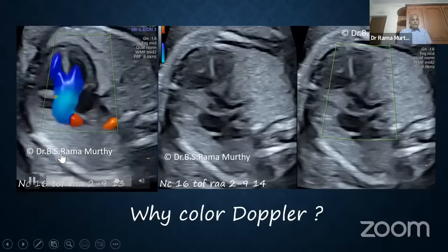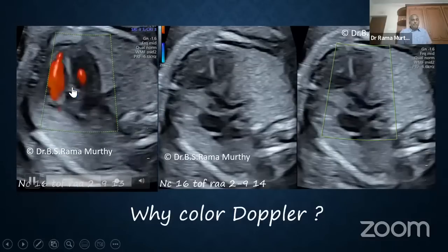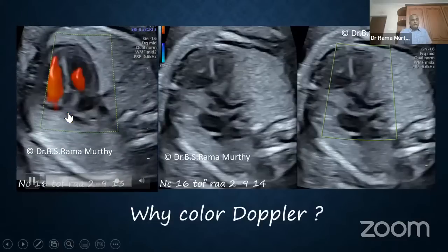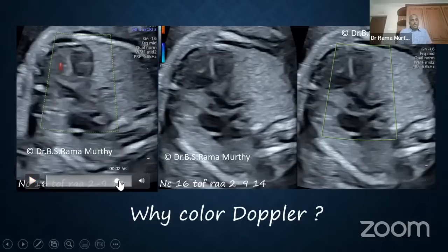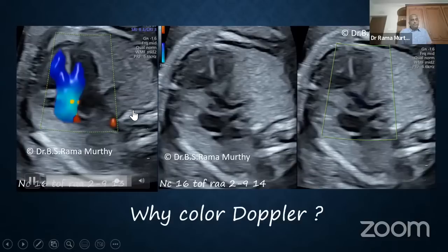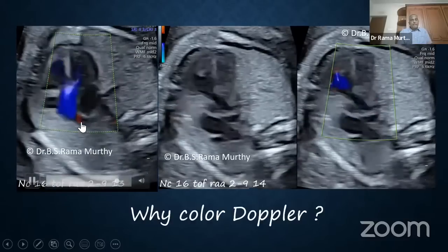This is an apical LVOT, and you find that both ventricles are pumping blood into the large aorta, right? Very, very well seen. And you will see that in this clip, when I come to this, that is the overriding aorta. You will also see a bit of the main pulmonary artery fleetingly coming here, showing you blue again. So I'm concentrating on that in this particular clip.